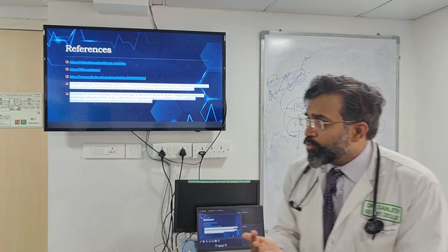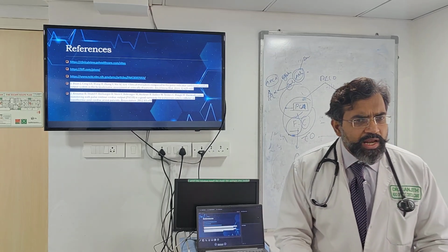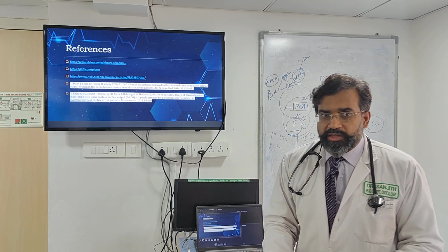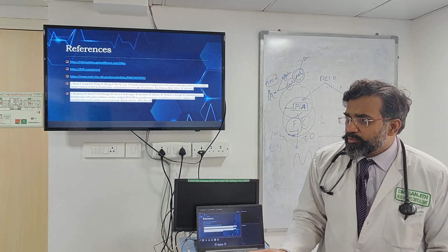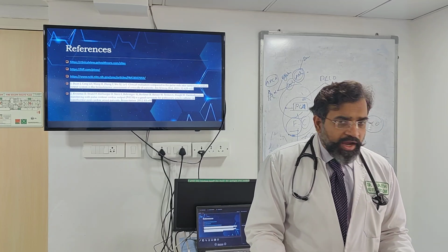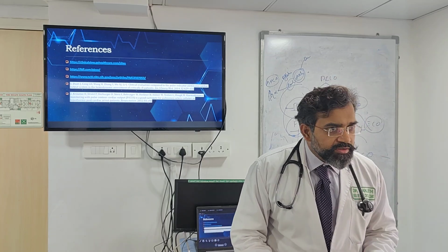So which are those indications? One is that you have had a change in the vasopressors. The second is you're given a fluid challenge. If you're given a fluid challenge, again the compliance will change because you suddenly put fluid inside the vein. You understand? So I want to do it again. Clear? And the third is when there is a difference of more than 15%.